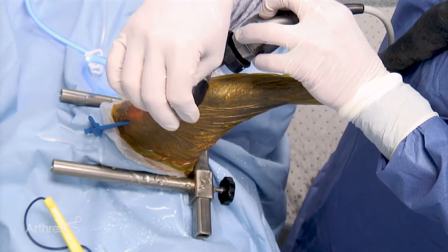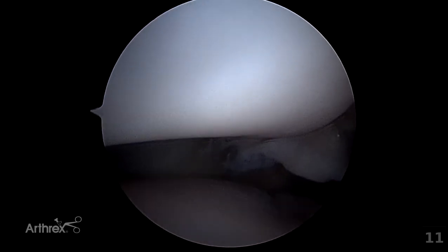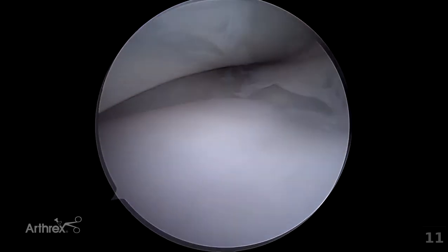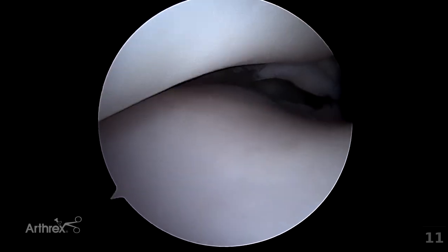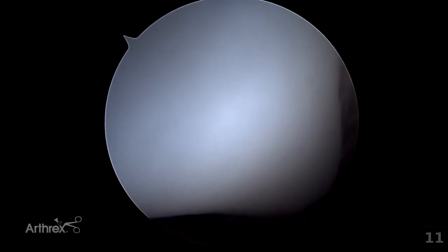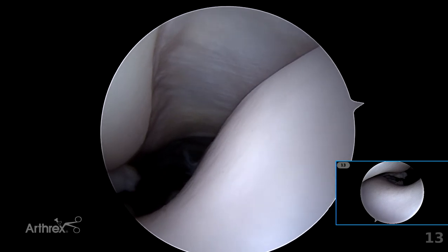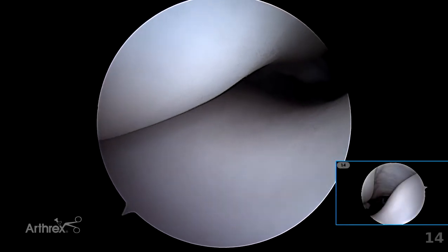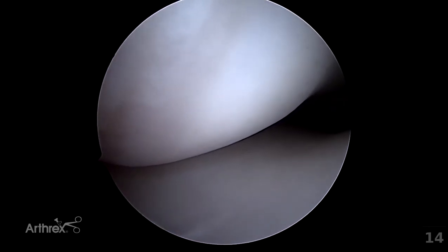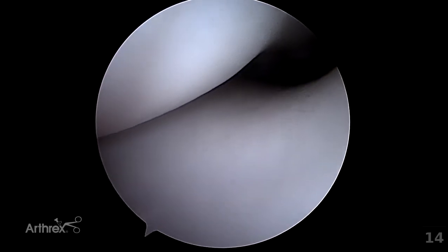By slowly rotating the post and moving distally, further evaluation of the undersurface of the patella, the trochlear groove, and the femoral condyles can be achieved. Assessment and grading of cartilage damage should be performed. It is important during this process to collect images. This will allow reassessment, re-evaluation, and staging of the joint disease, as well as contributing to a complete surgical and medical record. The distal pole of the patella can be evaluated at this position.